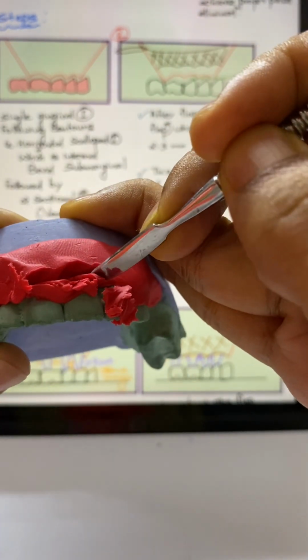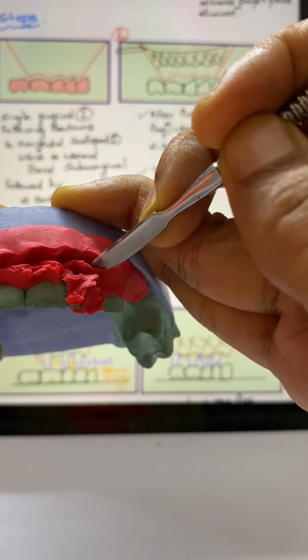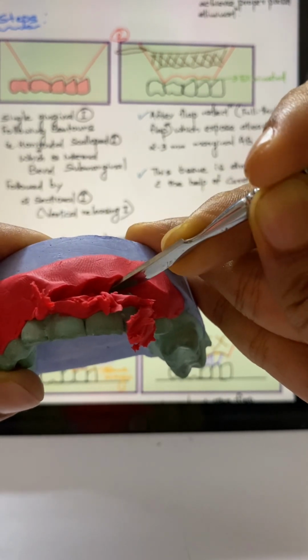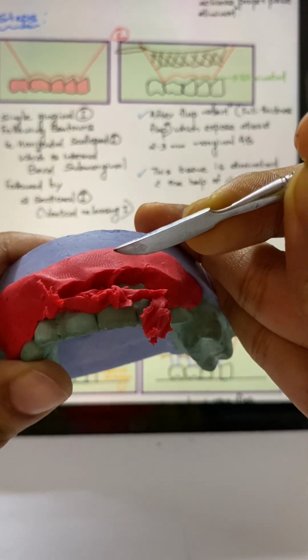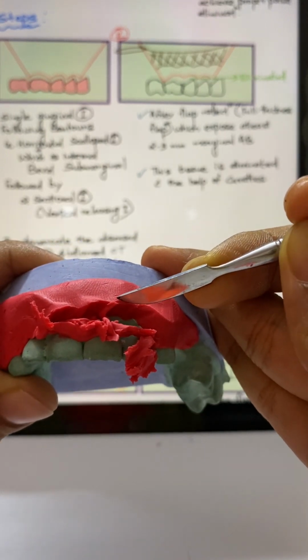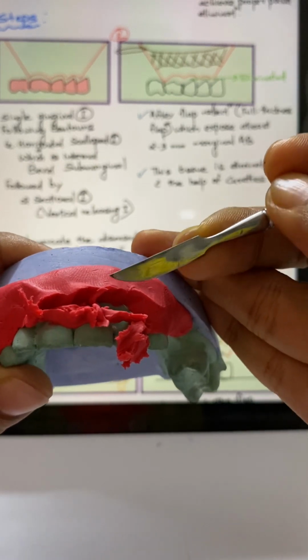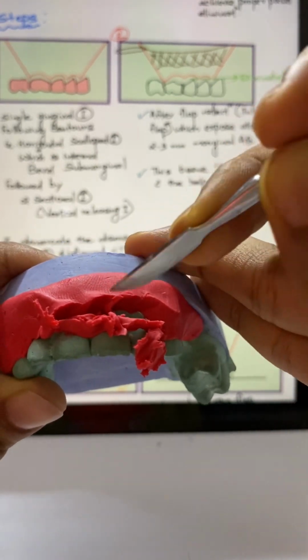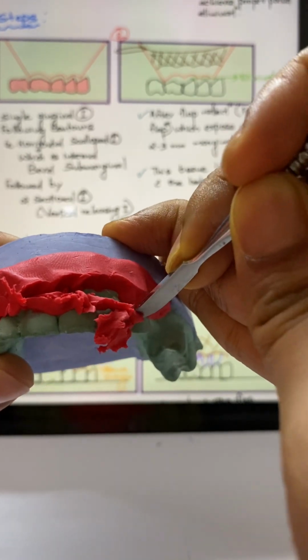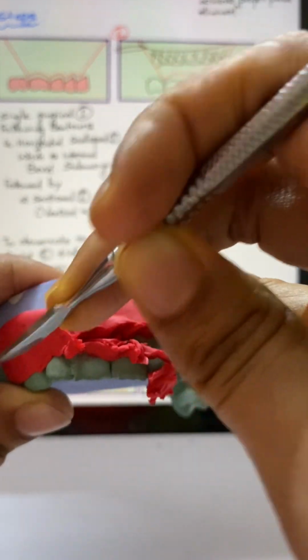In this model I cannot do it nicely, that's why like this. So why are we doing this? To demarcate the diseased pocket wall and inflamed connective tissue from the non-inflamed counterpart. So the first incision is like this, the internal bevel scalloped horizontal incision.